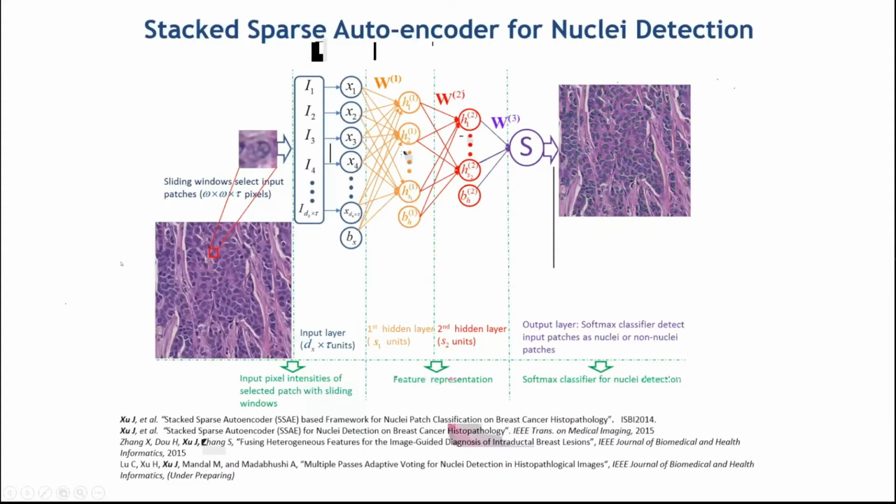Well, how do you go about building this? Well, one of the things that we realized we needed to do was to understand the tumor morphology. Well, we had to go in and identify the individual cells. We had to find the individual structures or primitives in the pathology image. And that's where deep learning has been such a boon, right? So we hear about deep learning pretty much everywhere. Like, how can you not hear about deep learning, right?